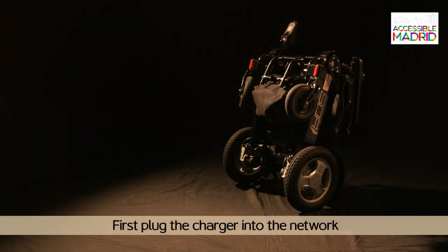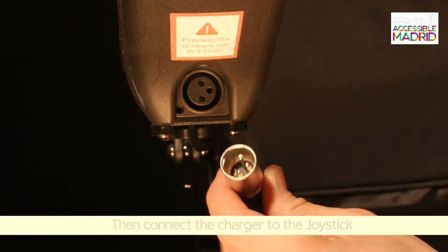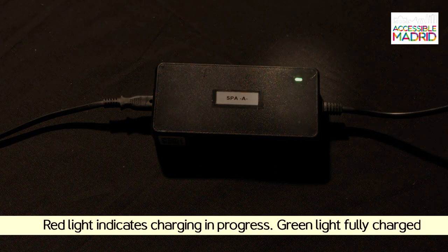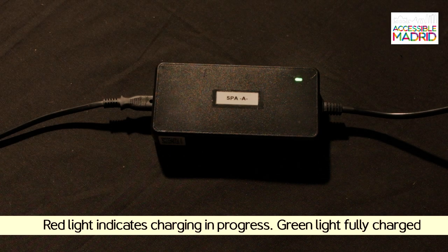To charge the chair's battery, first plug the charger into the network, and then connect it to the joystick. The battery indicator will appear red while charging, and green when charge is complete.